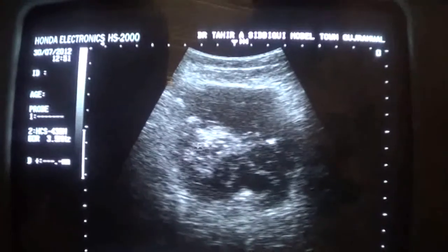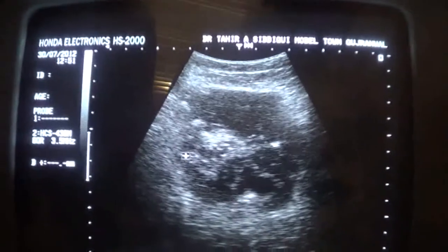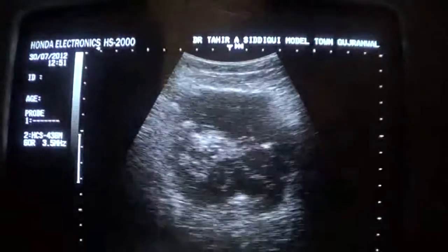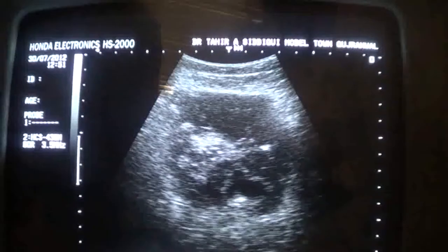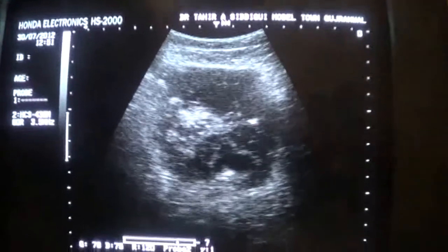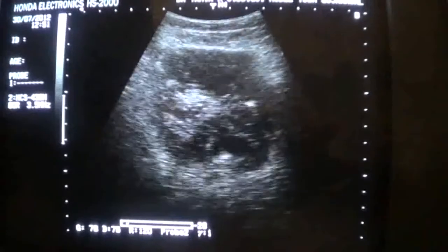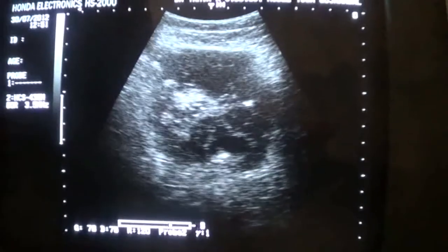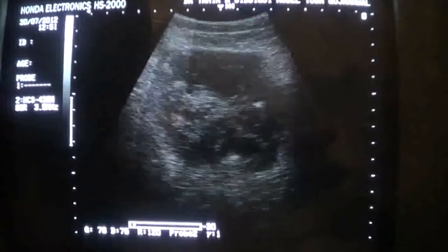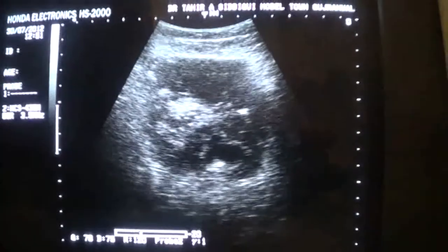No calcification is seen. This is not a calcification, rather this is a minor clot formation. So this is a study of subcutaneous collection with no intraperitoneal involvement, only 22 millimeter deep from the skin with an approximate volume of 300 ml plus minus.